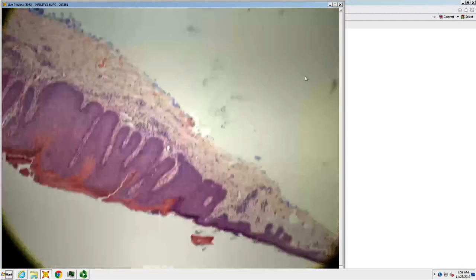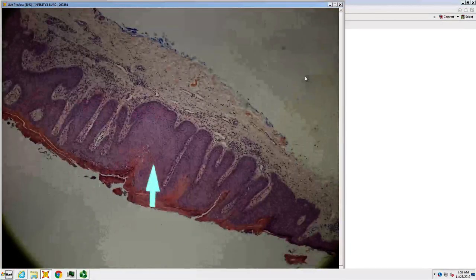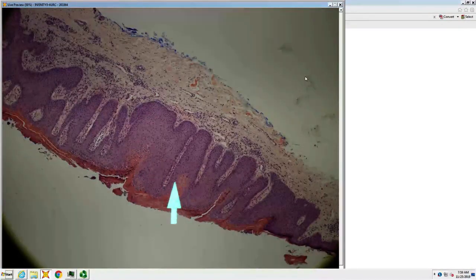Verruciform xanthoma. So I also heard someone say porokeratosis. The V's are a little like cornoid lamella, but there are no dyskeratotic cells at the base, and instead they're neutrophils. So all those red V's, wart on fire, screaming, the V's are screaming that it is a verruciform xanthoma. It's not fair.